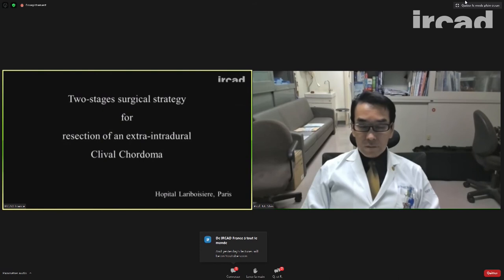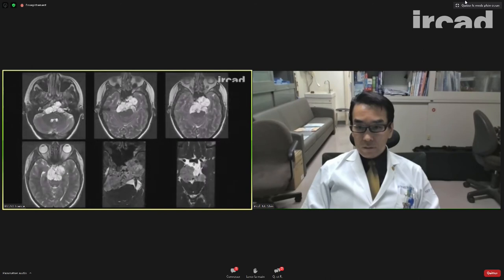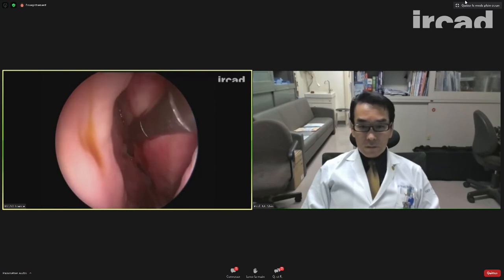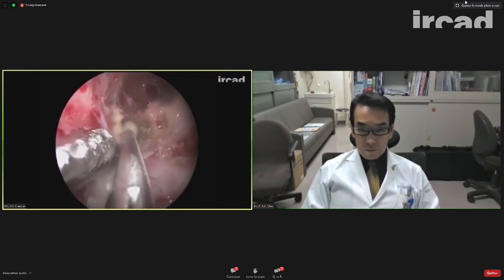Okay. So first stage, endoscopic endonasally through one nostril. We use this chopsticks technique, trying to keep all the endonasal structures intact. But definitely I will consider in the future trying or using maybe your technique.